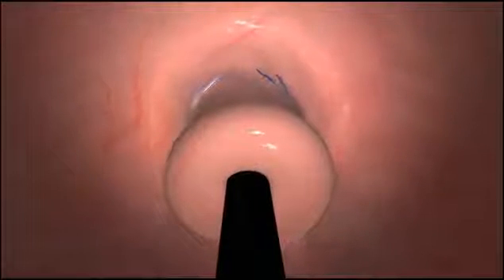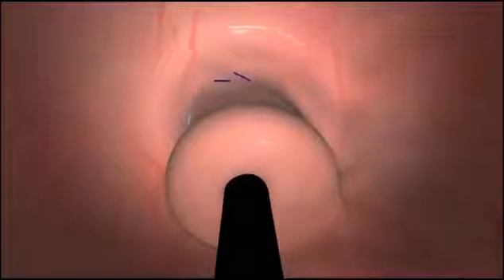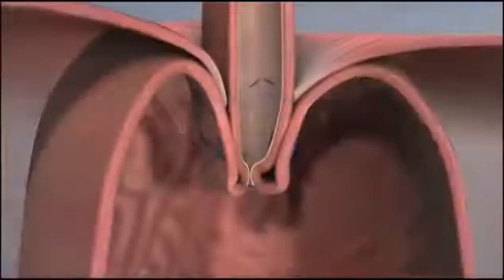The valve is extended, creating a long three to five centimeter flap and securing it with H-shaped fasteners.